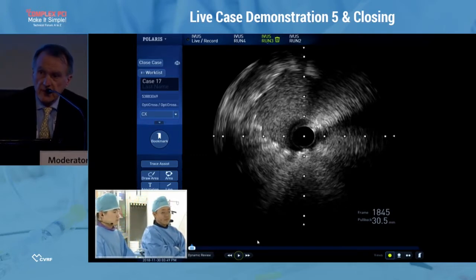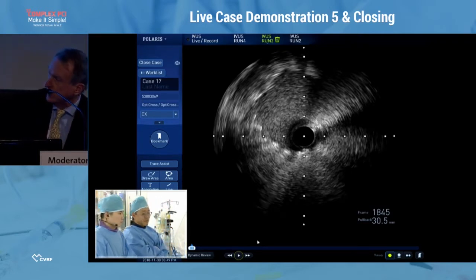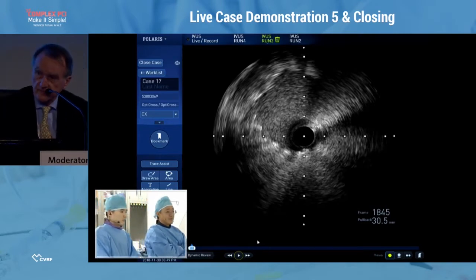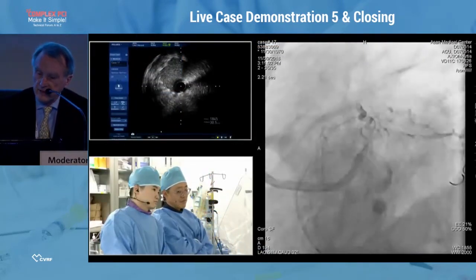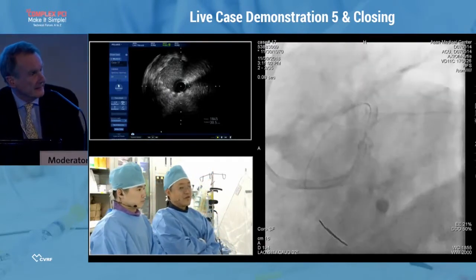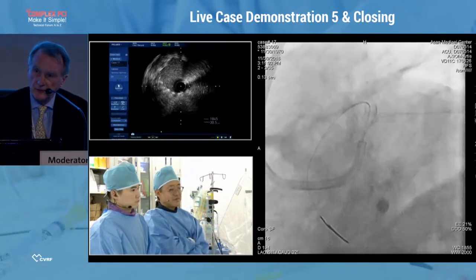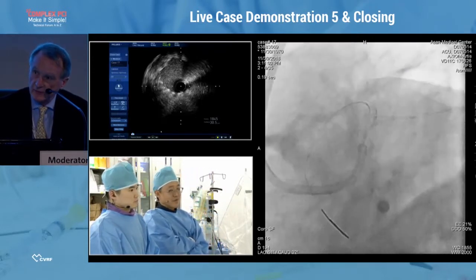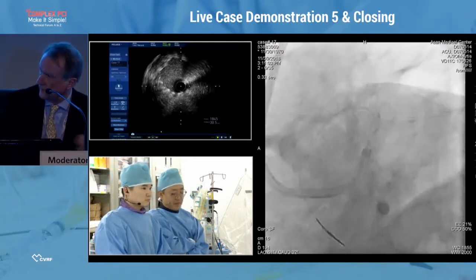Here, maybe it could be good on one vessel, so maybe you can just get away with one single stent. So, as always, if you can avoid to stent the circumflex, it is better. So I would do all my effort to optimize predilatation. After predilatation, I do IVUS, and I check with IVUS. If the result is good, I take one way or the other.